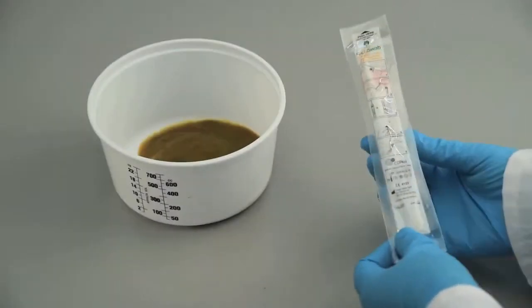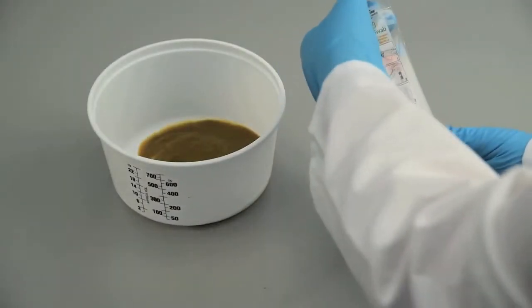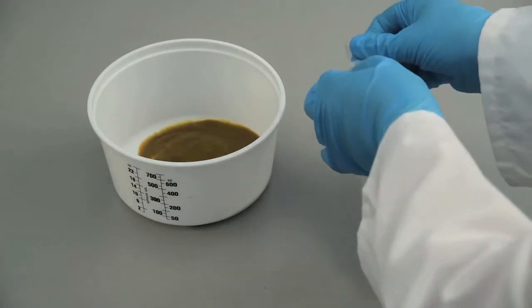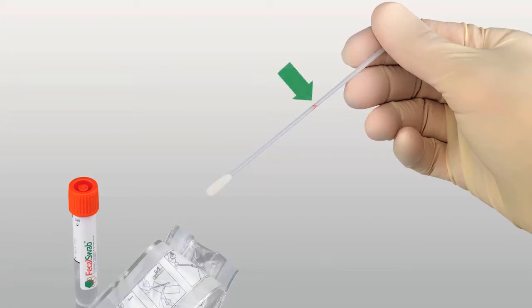Open the peel pouch and remove the tube and the flocked swab applicator. Do not touch the swab tip. Always hold the shaft applicator above the marked break point.